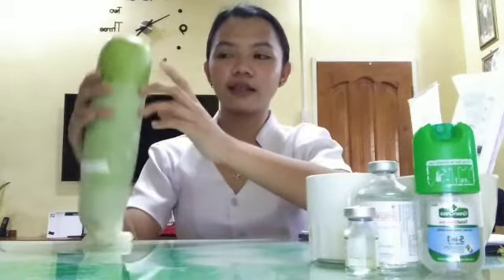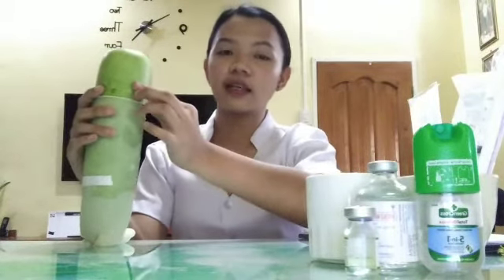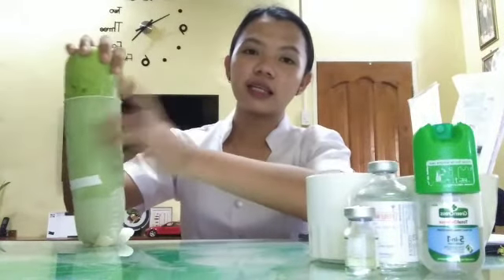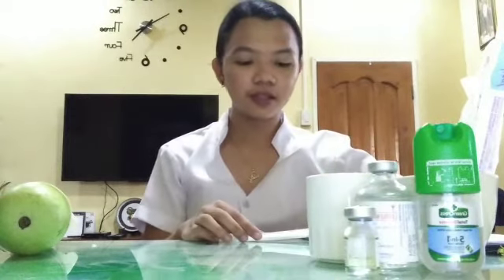So the upper arm of the patient will be this area. We will be administering the drug. So we will be using another tuberculin syringe, as if it is another drug.